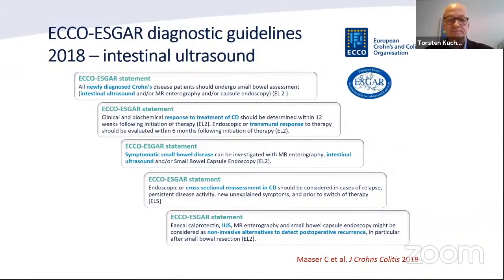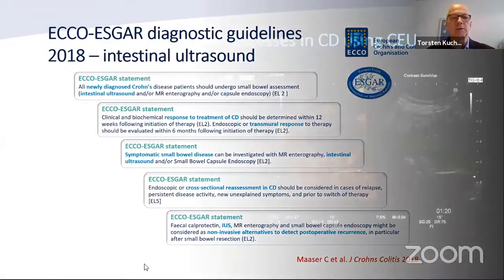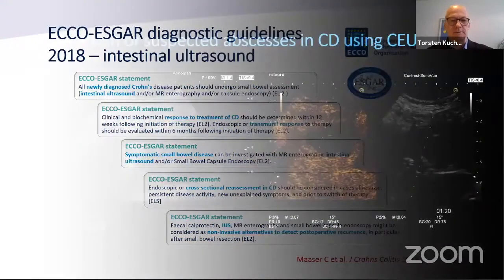And that's why intestinal ultrasound is now implemented in the ECCO-ESGAR guidelines. You've already seen this. Different statements include intestinal ultrasound. It's suggested in newly diagnosed Crohn's, for response to treatment, symptomatic small bowel disease, reassessment, if you want to predict disease outcome, or in the post-operative course. So in the different clinical indications, you can use intestinal ultrasound.